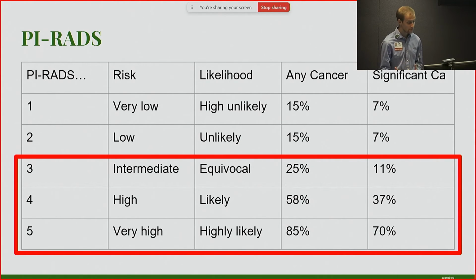So I usually tell them, well, a level 3 is something that we should probably look into. A level 4 is probably prostate cancer, but I wouldn't lose sleep over it. A level 5 is, I would tell you, I would definitely bet that it is a prostate cancer. Whether or not you need to do something or what you need to do really depends on the pathology.